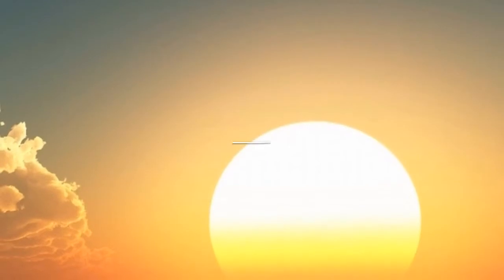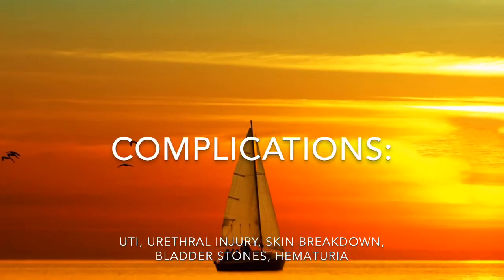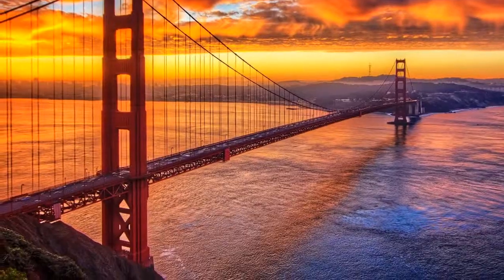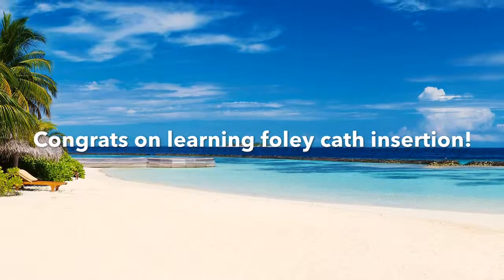Be on the lookout for possible signs of complication, including urinary tract infection, urethral injury, skin breakdown, bladder stones, and hematuria, or blood in the urine. You have now learned all necessary components of inserting the Foley catheter.